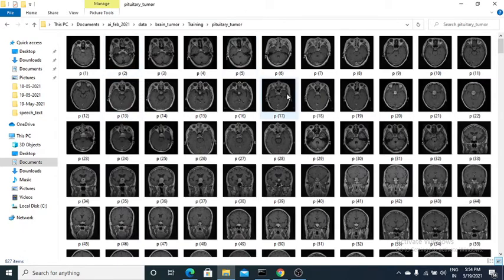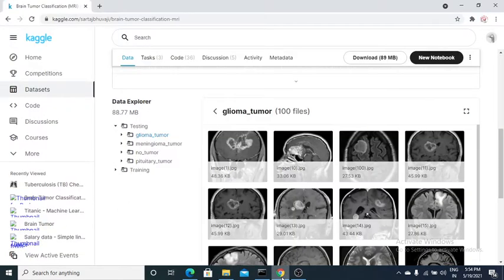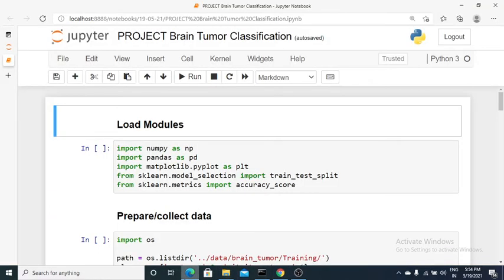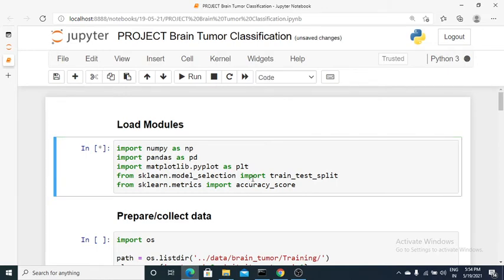I'll do each step starting from loading the data into a Jupyter notebook, then building a predictive model. I'll use an SVM model and compare its accuracy score with logistic regression. To get started, I'll first load modules — pandas and matplotlib. If you haven't installed any of those, you can simply run pip install numpy or pip install pandas.